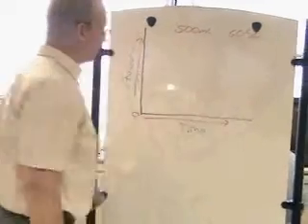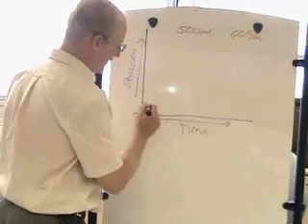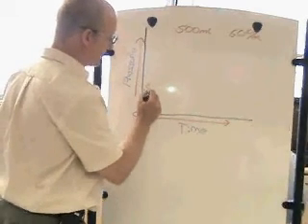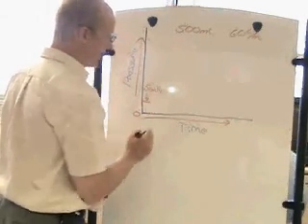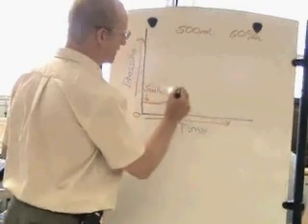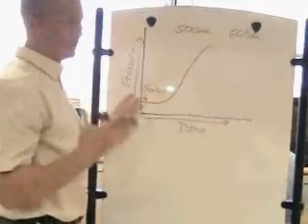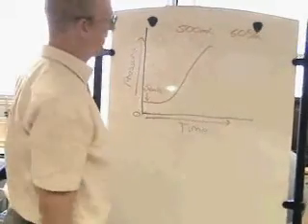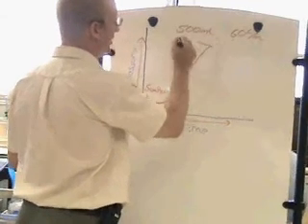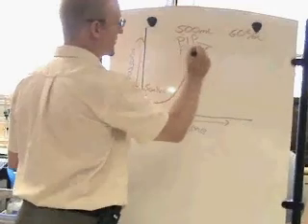Okay? When that breath starts to go in, you're going to see on this pressure time scaler the baseline pressure, which in this example we're going to call 5 centimeters of pressure, which obviously is your PEEP level. You'll see that pressure level increase because the ventilator is actually fighting against two different aspects to push that 500 milliliters into the patient's lungs. The very peak of the pressure is called the peak inspiratory pressure, also known as the peak airway pressure by some authors.